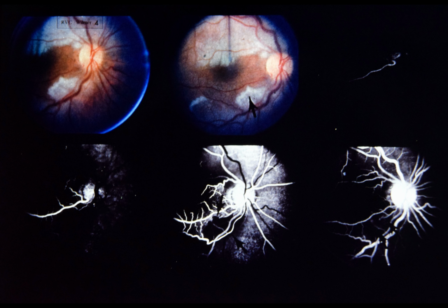Note how retinal infarction immediately below cilio-retinal artery corresponds with large cotton wool spots seen upper center. Lower right, 3 minutes after injection, note normal filling pattern of all vessels. Leakage from terminal arterioles below papillomacular bundle indicates hypoxic damage to vascular endothelium. Comment: this patient's cilio-retinal artery in the right eye has enabled her to maintain 20/30 vision in that eye despite a central retinal artery occlusion.